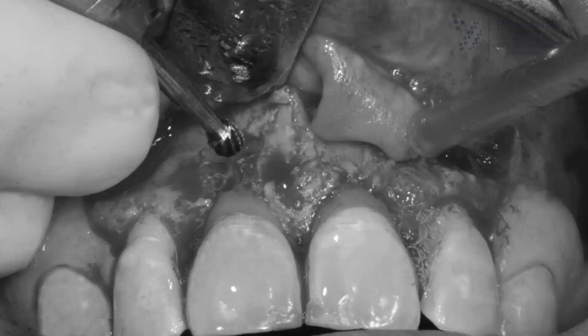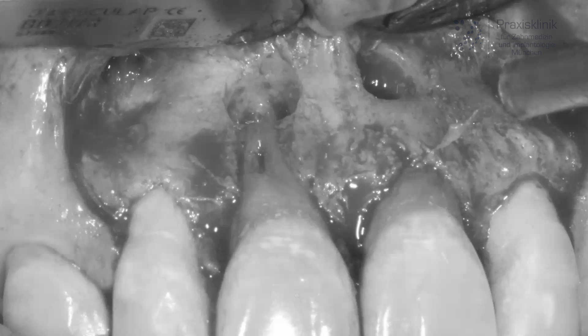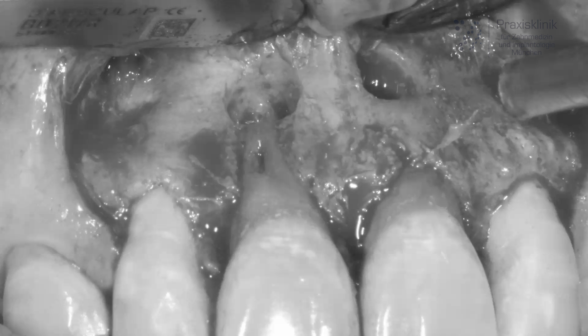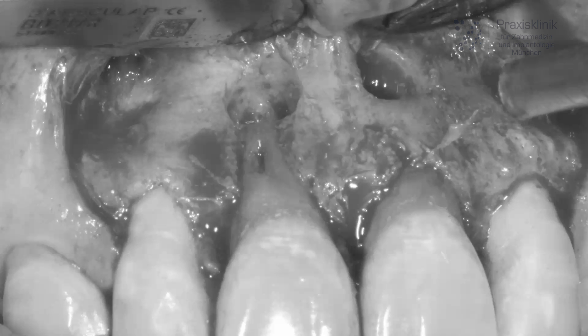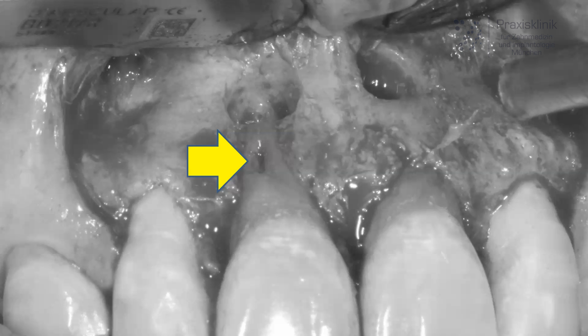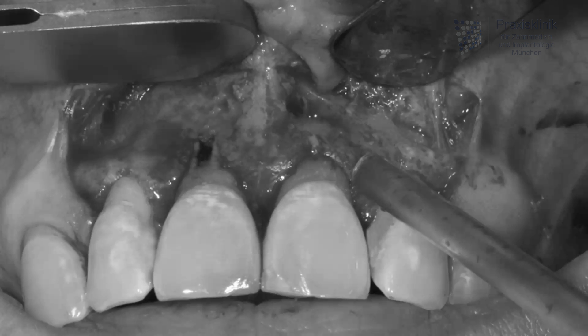After removal of the inflammation, we cut again the tip of the root — clean it, so to speak — as you can see here on both teeth. In the area of the tooth where there is a small external resorption, indicated with a yellow arrow on the left central incisor, that needs to be filled with a bio-cement called MTA.